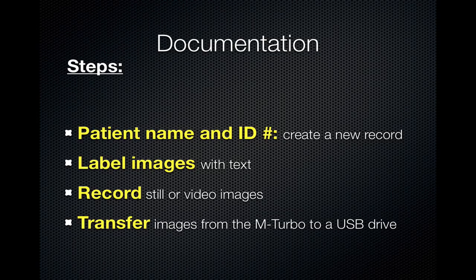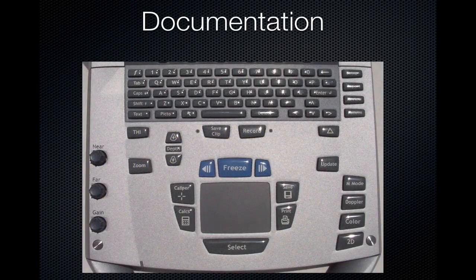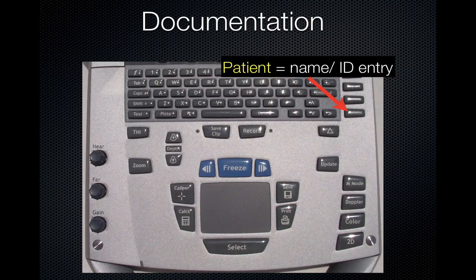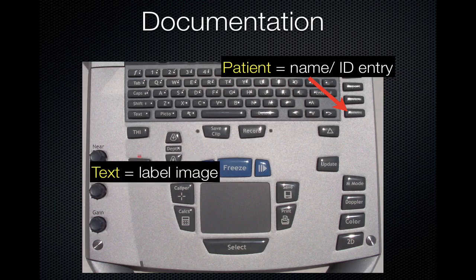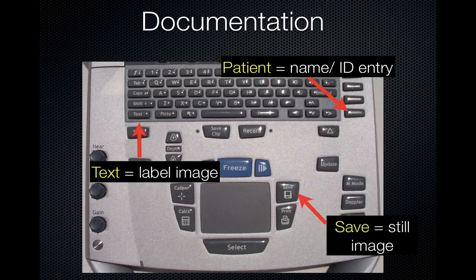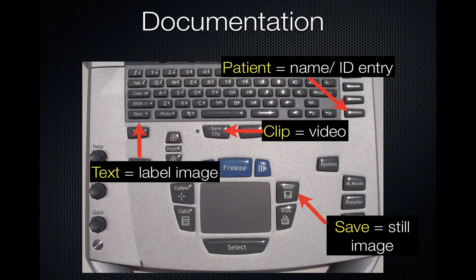Here is a demonstration. The Patient button, when pressed, provides a screen that allows you to enter the name and identification number. The Text button, when pressed, allows you to type from the keypad onto the image on the screen. The Save button will save a still image or screenshot. The Clip button will record a clip ranging between 2 seconds and 30 seconds — generally 4 seconds is the recommended length.